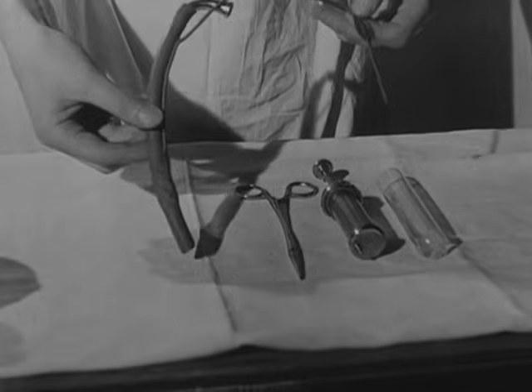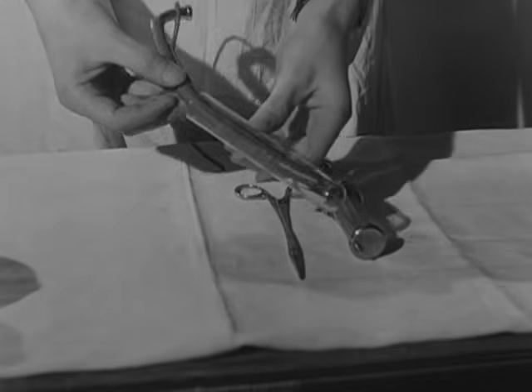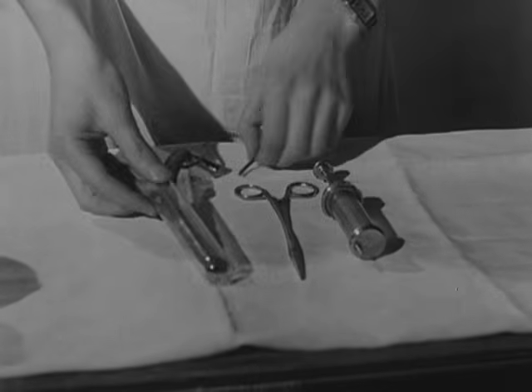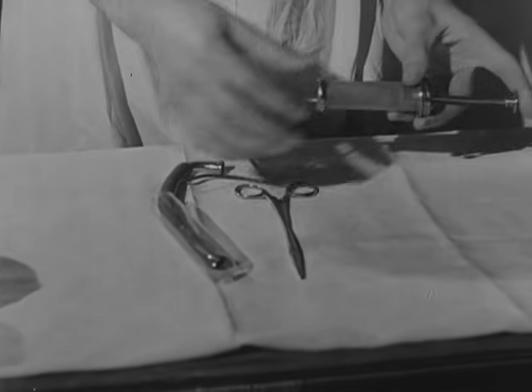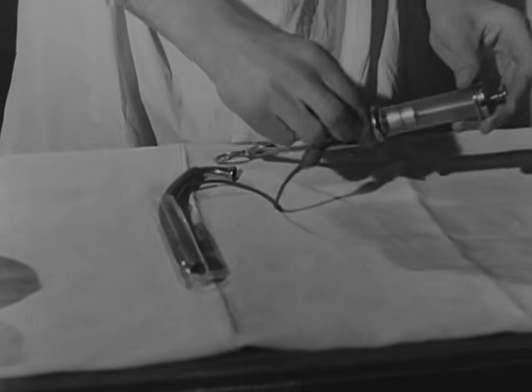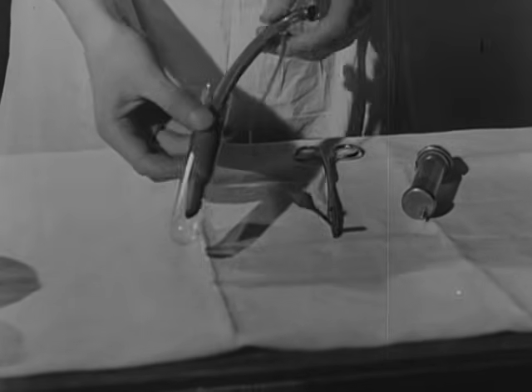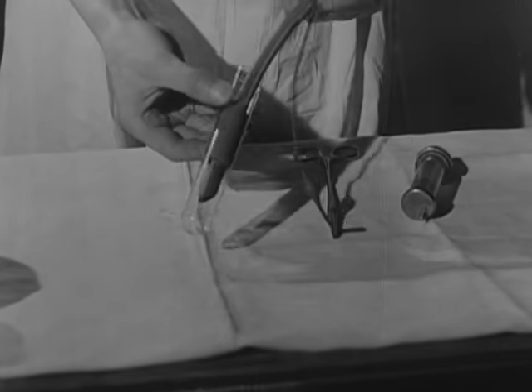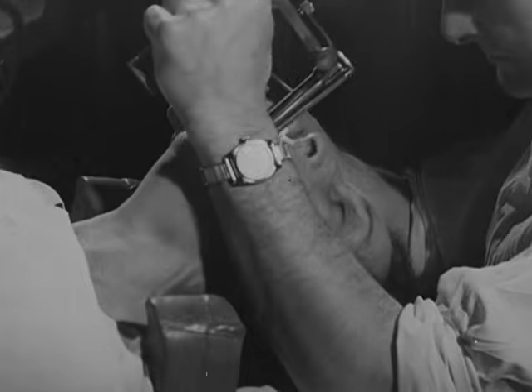An alternative to gauze packing is the Goodell Waters Inflatable Cuff, fitted onto the endotracheal tube itself. The tube fits quite loosely into a test tube so long as the cuff is deflated. Air is pumped into it by a syringe attached to the supply tube. This is then clamped off. As you can see, the cuff now fits firmly against the walls of the test tube that makes a watertight packing. The cuff tube is inserted into the trachea in the same way as an ordinary endotracheal tube.